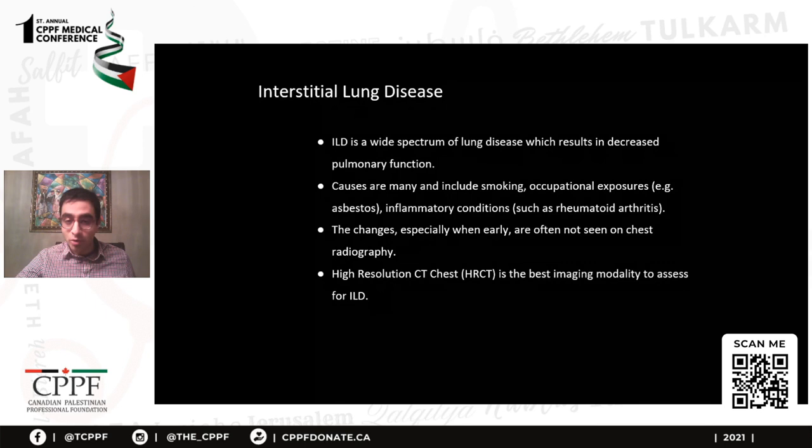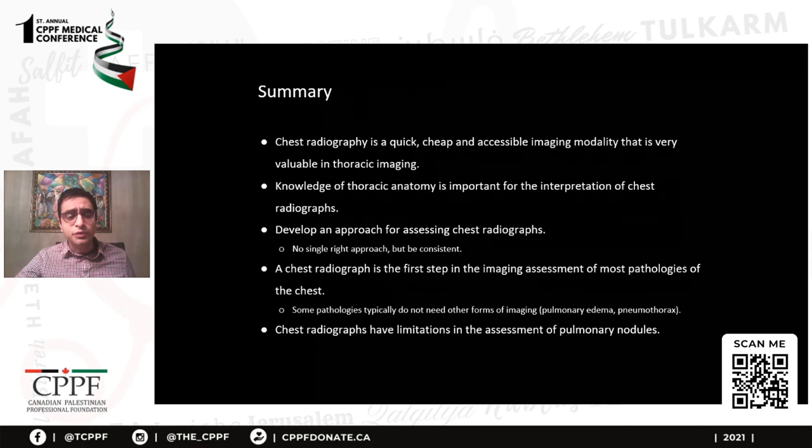So in summary, we've gone through a number of exercises. I hope these were useful to cover some of the important concepts in thoracic imaging that you probably see on a frequent basis. Chest radiography is a quick, cheap, and accessible imaging modality that's very valuable for thoracic imaging, and it's important to know thoracic anatomy. Definitely develop an approach for assessing chest radiographs, and know that it's often the first step in many pathologies. They do have some limitations, for example, in the assessment of pulmonary nodules and also interstitial lung disease, and in both of these cases, it's reasonable to request a CT.